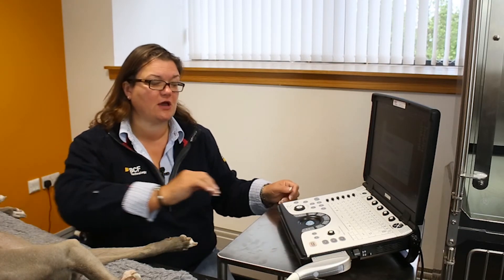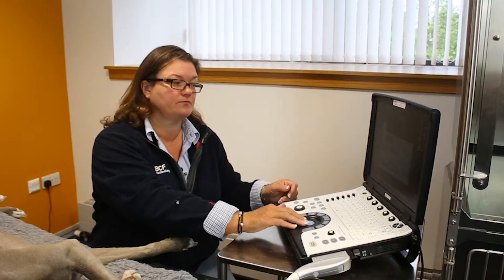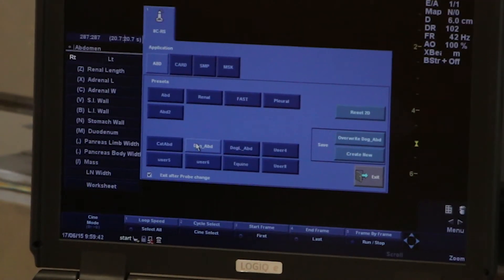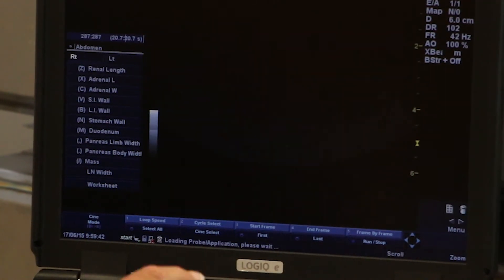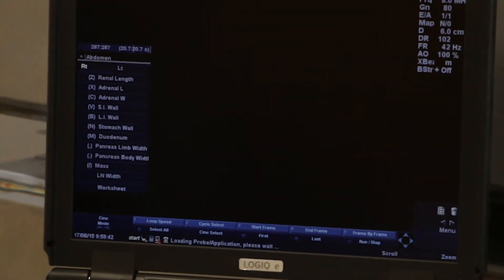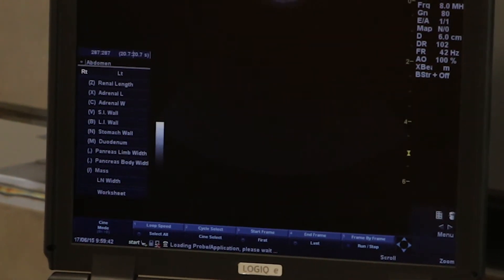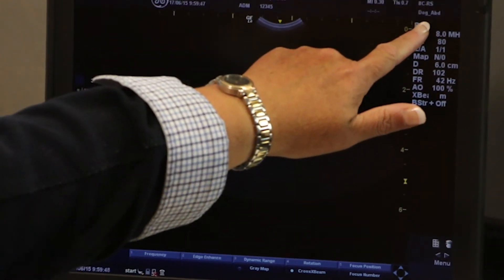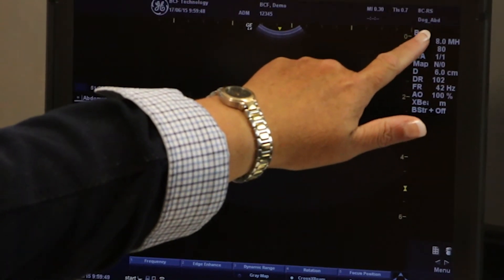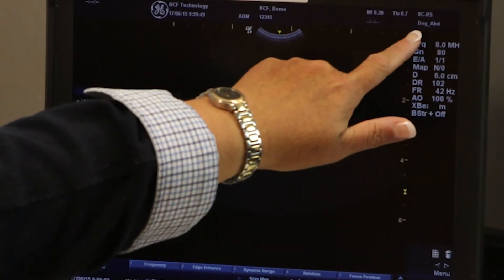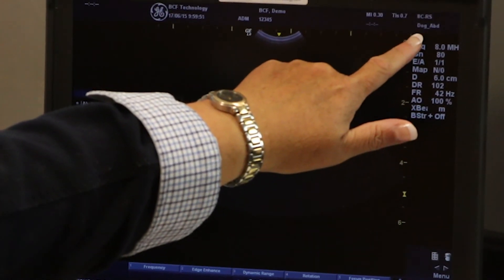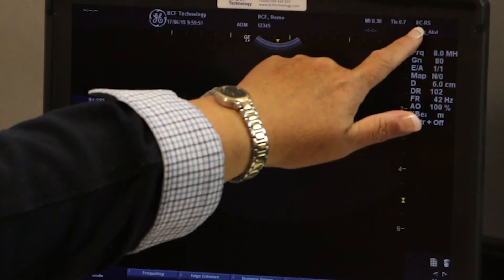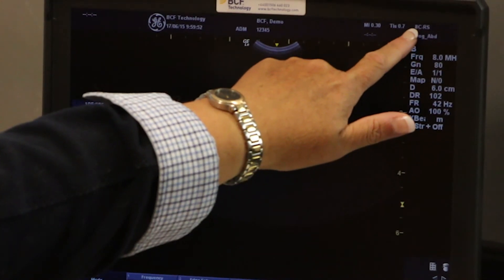We'll select dog abdomen, and you'll see that the preset you've selected is shown at the top right hand side of the screen, underneath the probe selection.